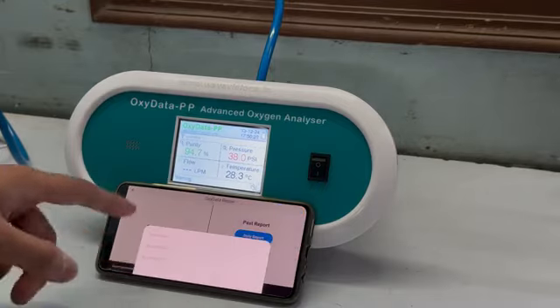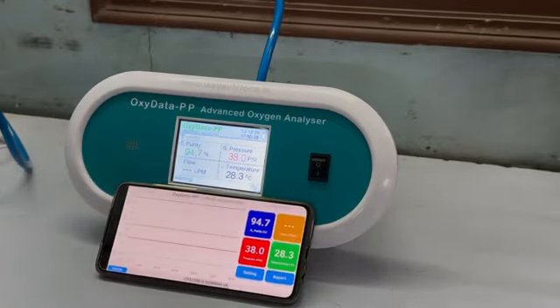And for the monthly, the same thing will go. And so this was the local device mode.